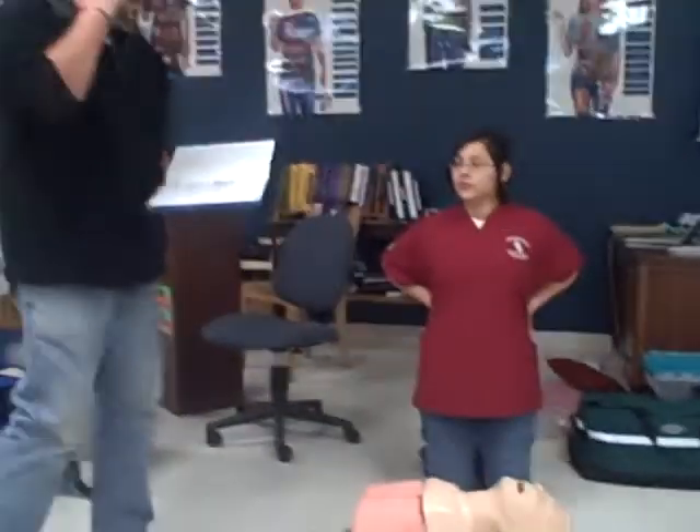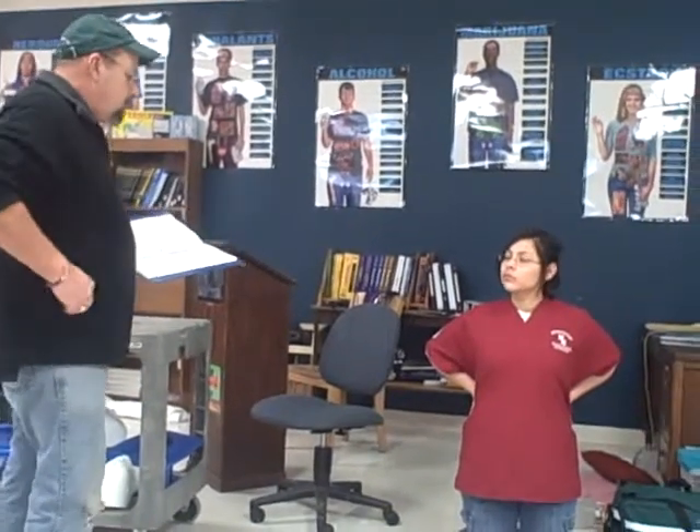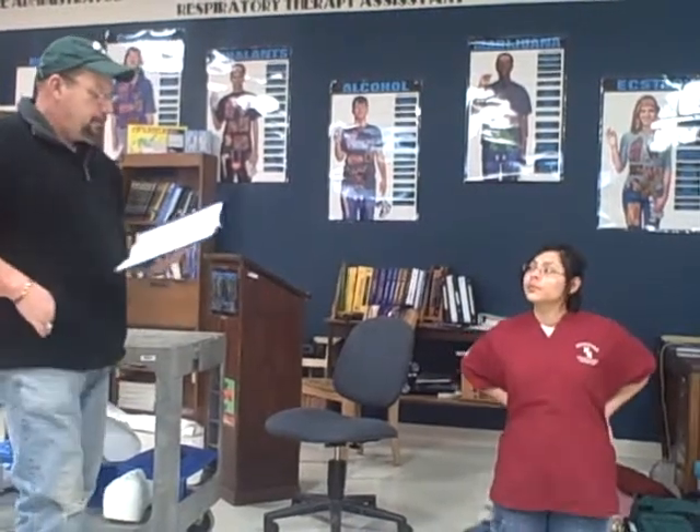Welcome to the bag valve mask of an apneic patient's station. You will be required to provide ventilations to a patient who is apneic. Do you have any questions? May I take my equipment? Yes, you may.